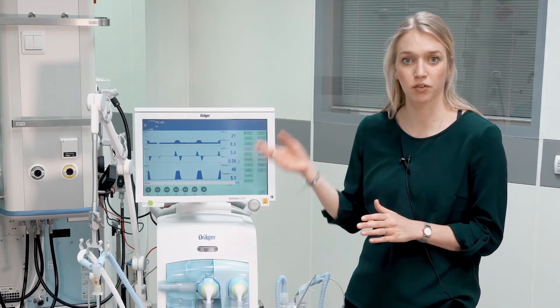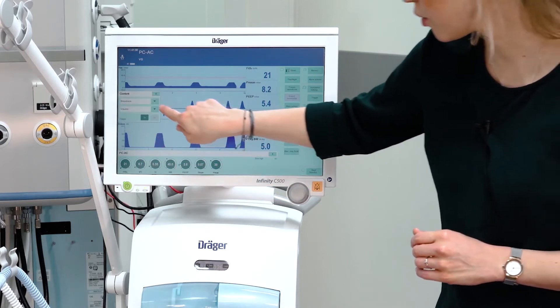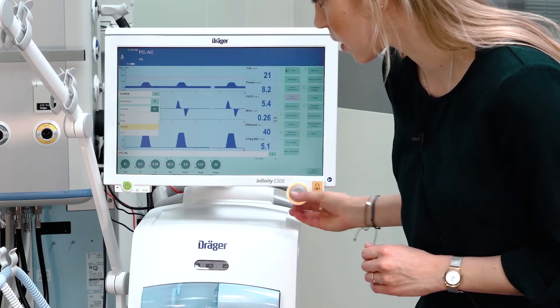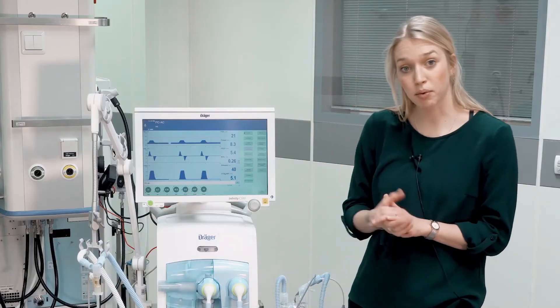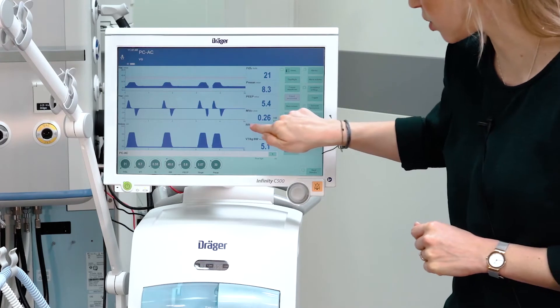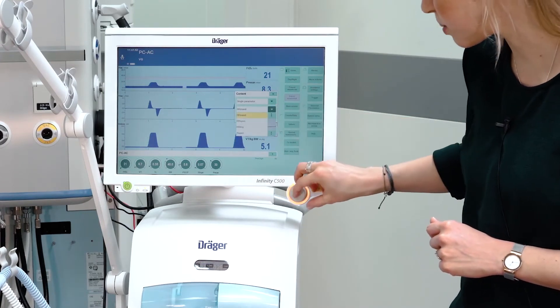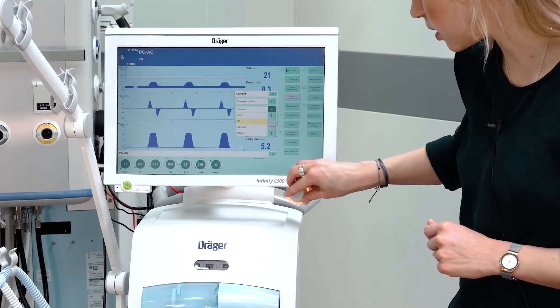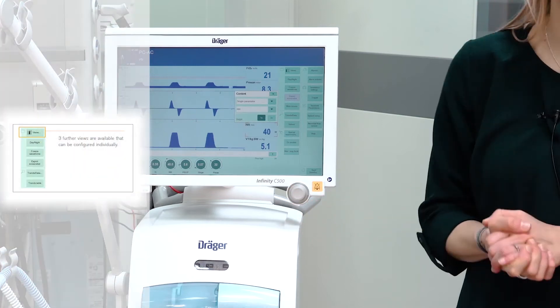If you want to apply changes to the displayed waveforms or measurements, please press on the respective waveforms and select a different parameter from the list. In the same operating philosophy, you can change the respective measurements by choosing the measurement and display the desired value by confirming the rotary knob.